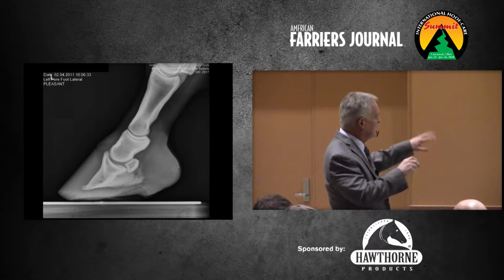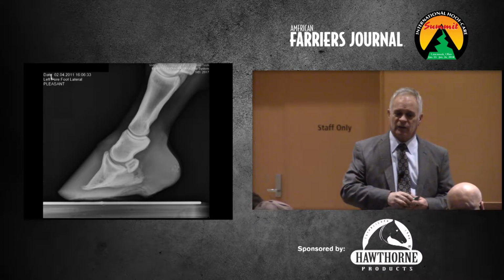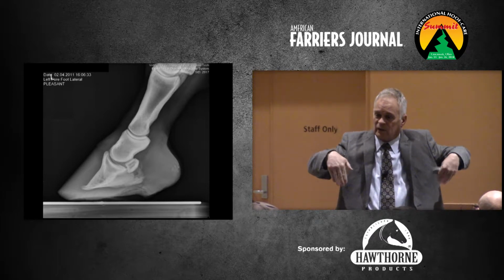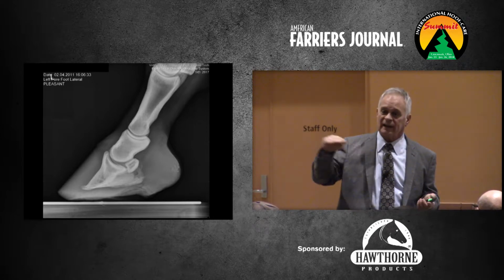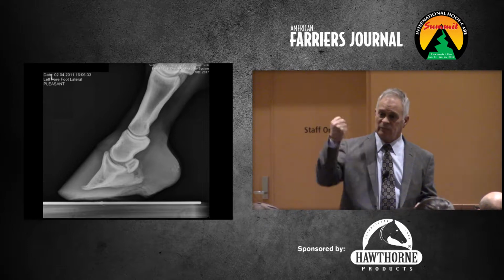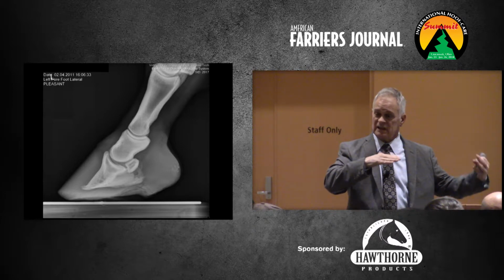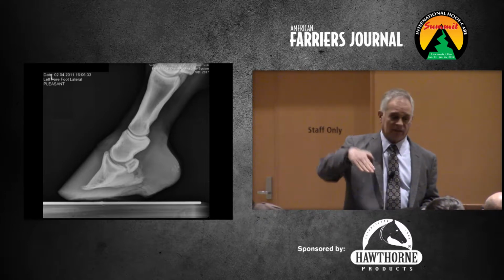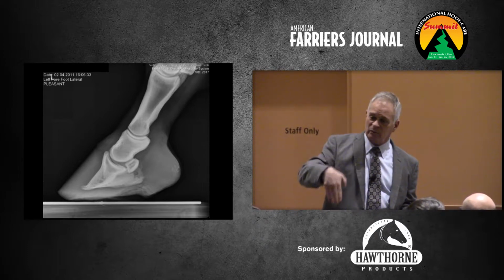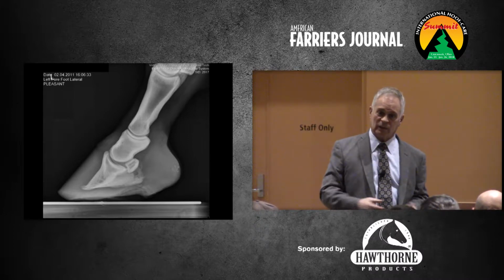Yeah, so the comment was, it looks like she has a flexion of that. And so I think that's more of a chronic, it's almost like a club foot at that time. She's been up that way for so long, that's just the way she's standing. So when you start letting that heel down, you've got to do it carefully, because you're creating a tug of war between the deep and the weakened lamellae. And the deep will always win that war. So some horses, like she did, will let you go perfectly flat. Other ones, you're going to find what we call their happy spot, where that's as low as they're going to go. But we know P3 doesn't like to be loaded point down. It really likes that bigger surface area to stand on. So we get them as flat as they will stay comfortable.